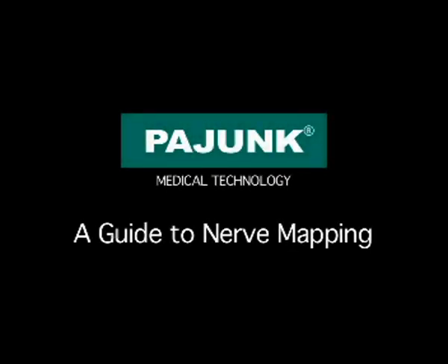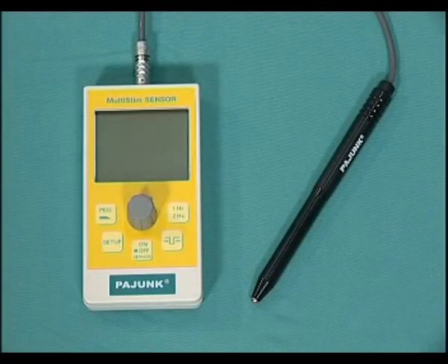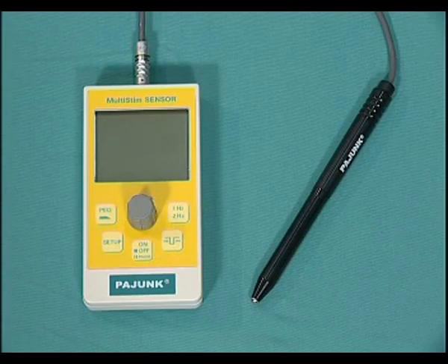The following CD demonstrates the concept of nerve mapping using the Pajunk nerve stimulator. Anaesthetists will demonstrate the location of the peripheral nerves commonly blocked in regional anaesthesia. The Pajunk multi-stim sensor consists of a control box and peripheral electrode.